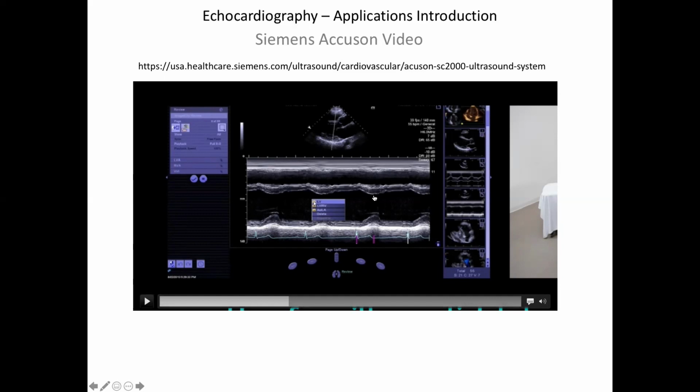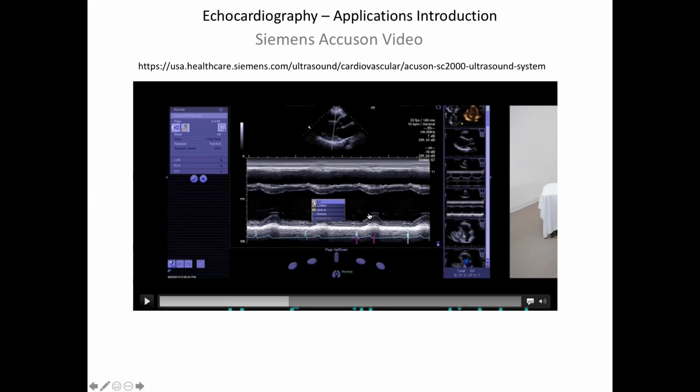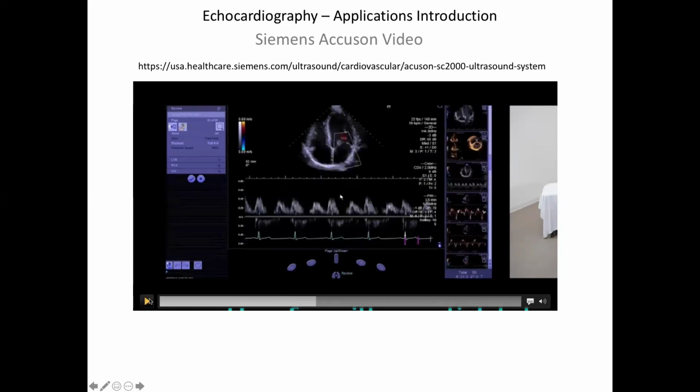There are dynamics also in these derivatives, right? In the temporal derivatives of these curves, in that, is the heart contracting in a sluggish way, or is it twitching or aggressively contracting? And so some of those derivatives can be measured. And you can do that also with the velocity, as we'll see. So here's some of the parameters that can be computed.